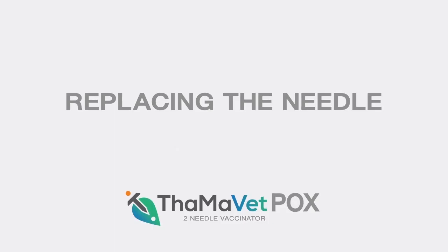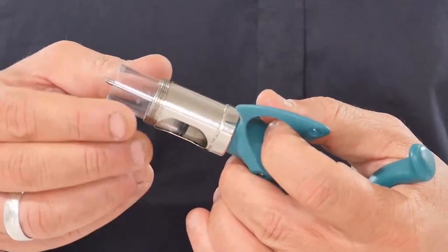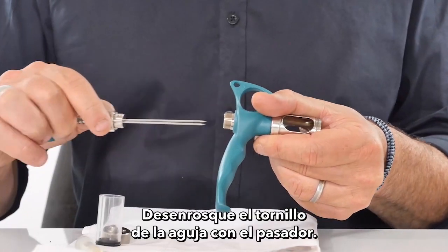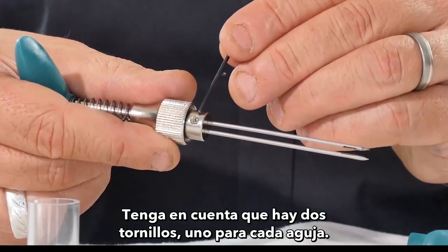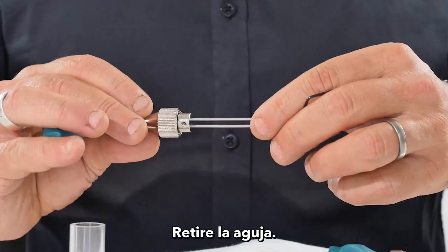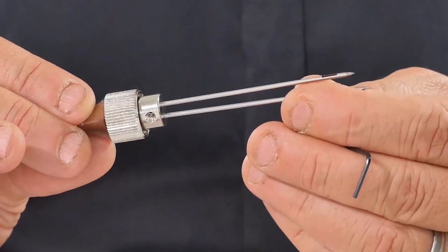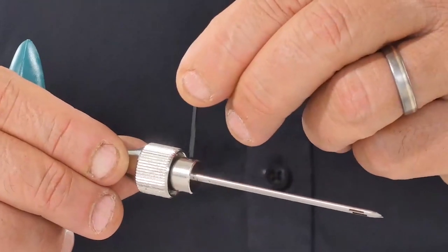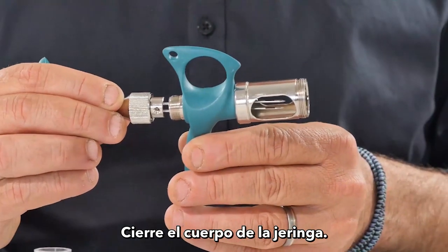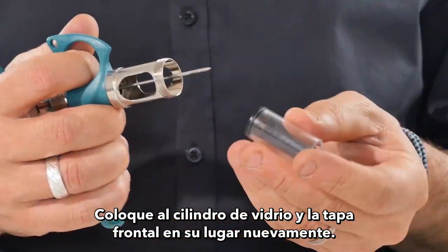Tama pox to needle vaccinator: replacing the needle. Take out the glass barrel, open the syringe body, unlock the needle screw using the key pin. Note there are two screws, one for each needle. Remove the needle, put a new needle in place, and screw it back. Close the syringe body, put the glass barrel and end front cap back into place.